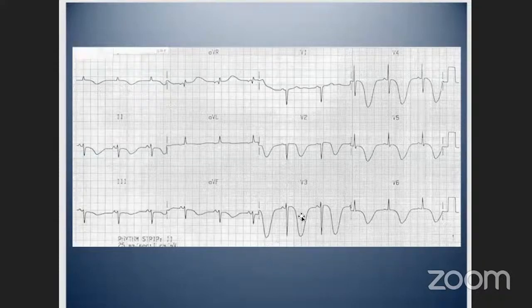And I can see that this is bigger than half of the RR interval. And so this is a prolonged QT, but this is also quite a pathognomonic ECG, and it shows that these are cerebral T waves. So a very prominent feature in a traumatic head injury or even intracranial hemorrhage with elevated intracranial pressures.